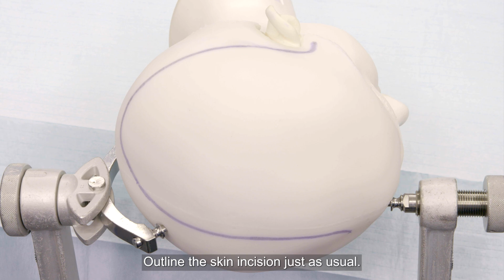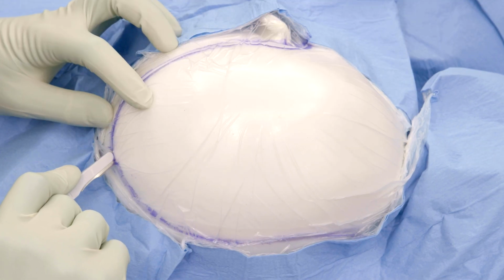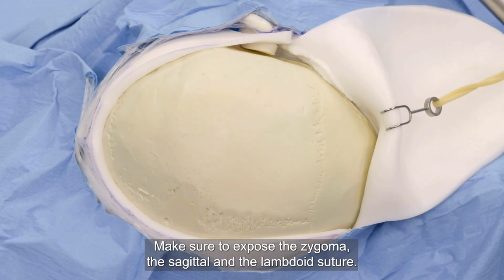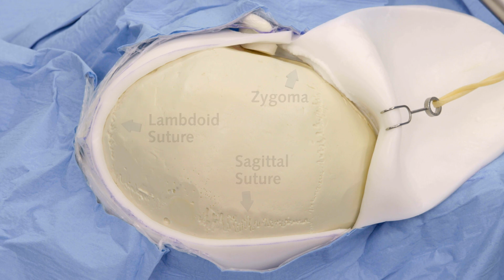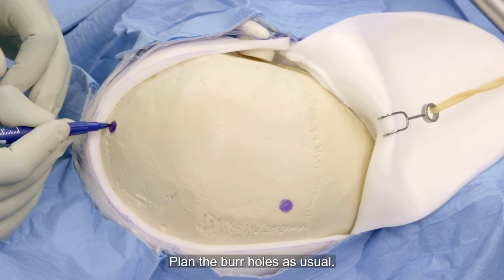Outline the skin incision just as usual. Prepare the galeal flap. Make sure to expose the zygoma, the sagittal, and the lambdoid suture. Plan the burr holes as usual.